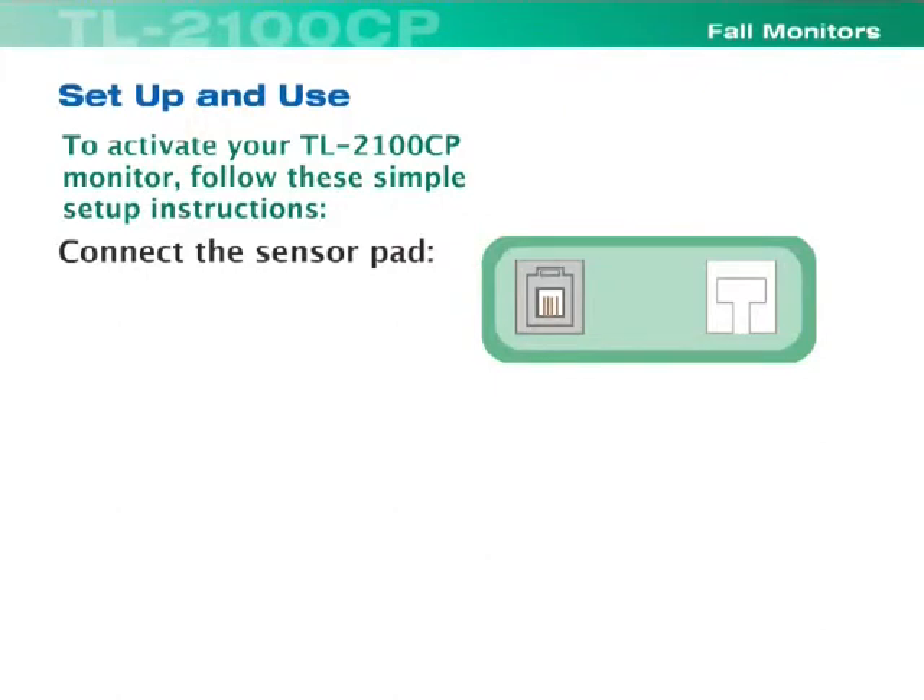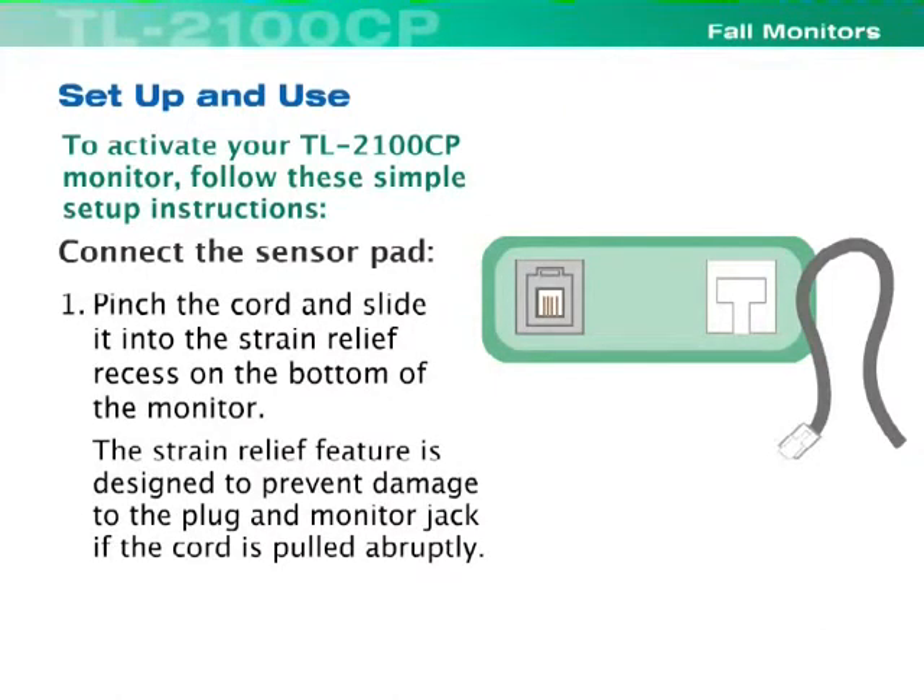Connect the sensor pad. Pinch the cord and slide it into the strain relief recess on the bottom of the monitor. The strain relief feature is designed to prevent damage to the plug and monitor jack if the cord is pulled abruptly.